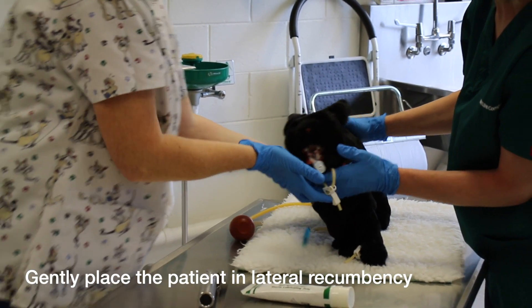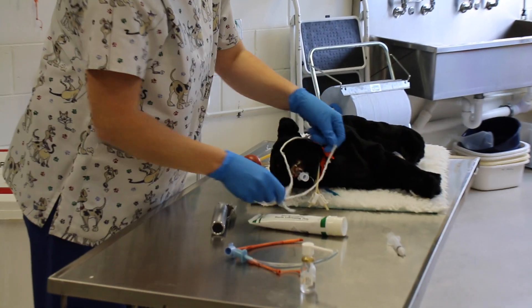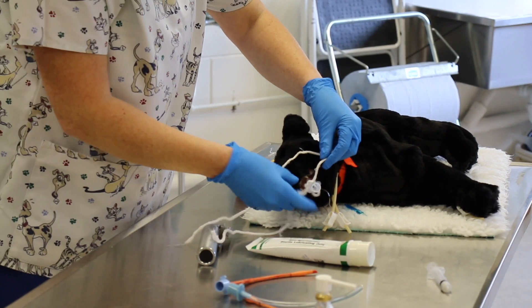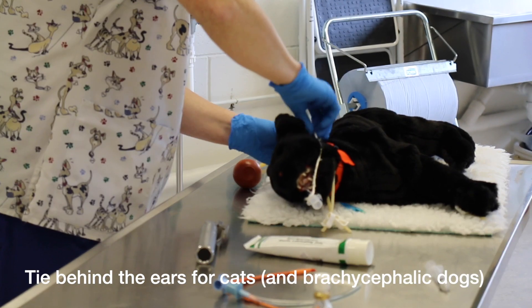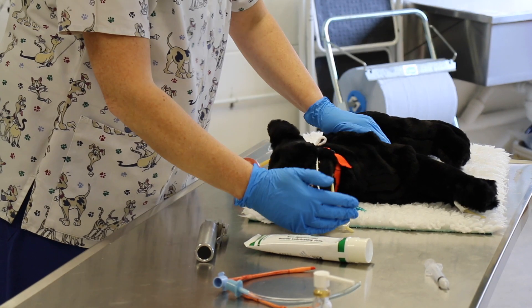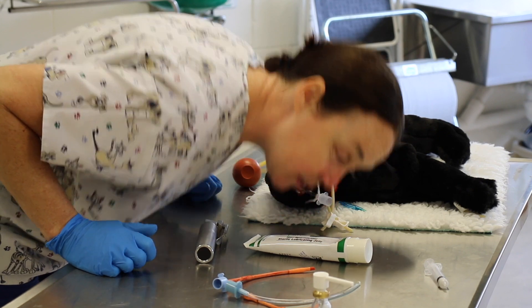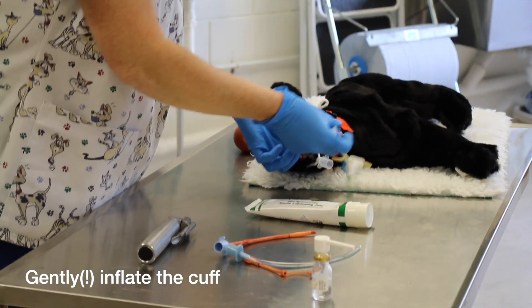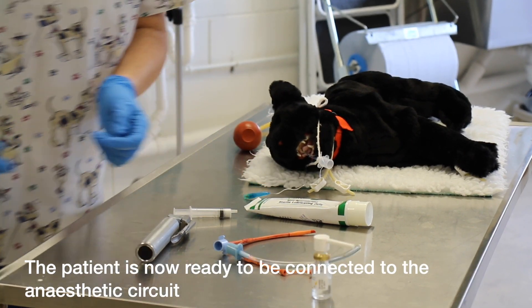Now get the patient back into lateral recumbency and secure the tube in place. The tie goes behind the connector — not over the tube, as that would occlude the airway. Tie it securely behind the ears. Check placement by using a piece of hair, pressing on the chest, or placing your face near to feel for a breath. Once happy, very carefully inflate the cuff. The patient is now ready to be connected.